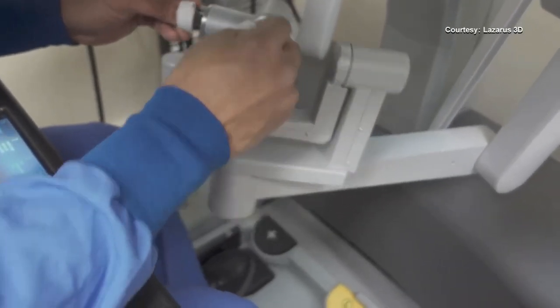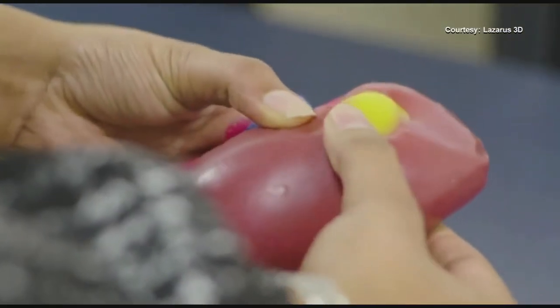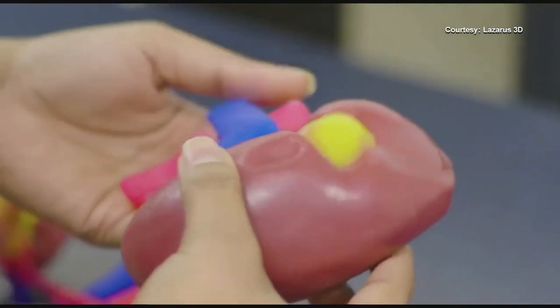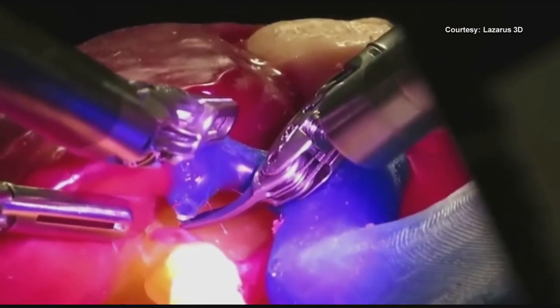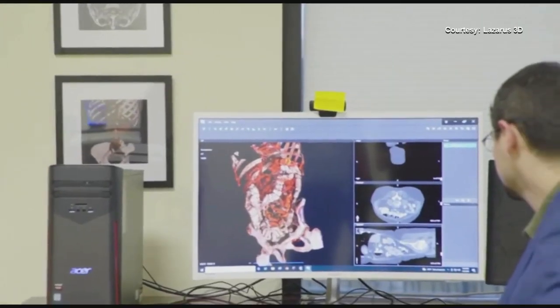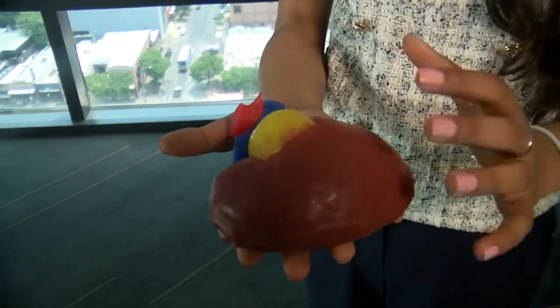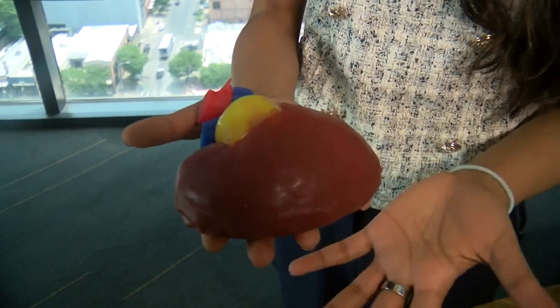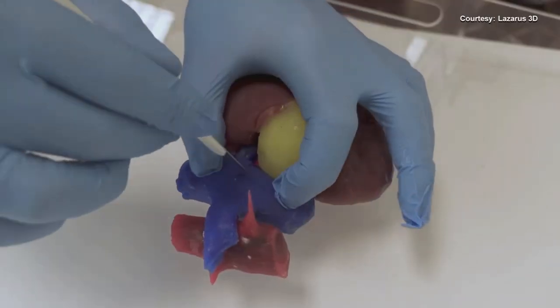They use MRIs and CT scans to build an exact soft tissue replica of the patient's organ with the tumor or tissue that needs to be operated on, so a doctor can rehearse cut for cut before surgery. This is a kidney of a patient with kidney cancer. They built this PRE-SHURE model for that patient, where the surgeon used it to first assess the anatomy and assess the critical structures surrounding the tumor.